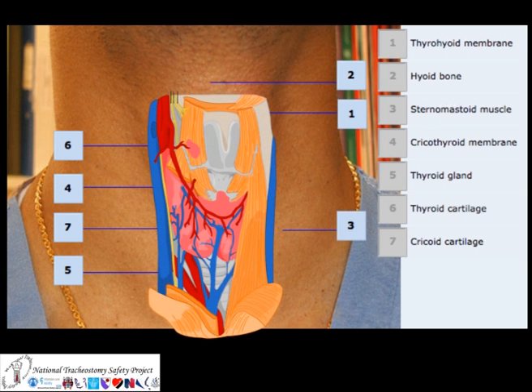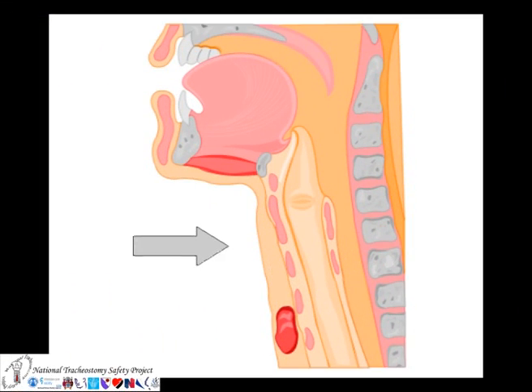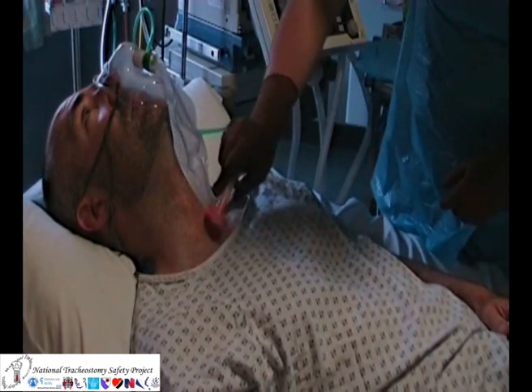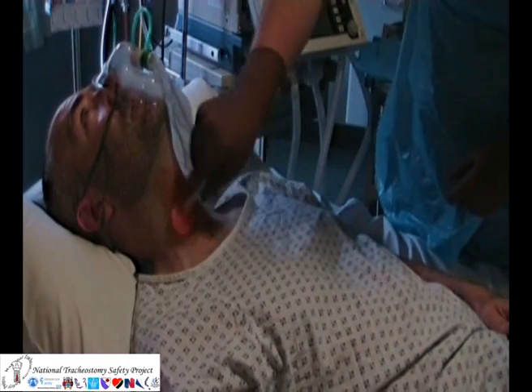There are important vascular and anatomical structures in the anterior part of the neck, but using the cricothyroid membrane is a relatively safe approach to the trachea. If time allows, the anterior neck should be cleaned with an appropriate skin solution, and the area prepped as a sterile field.